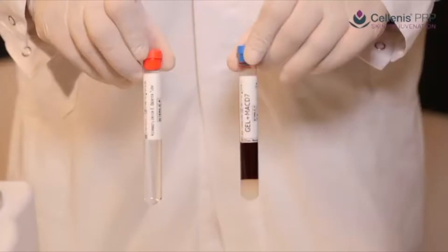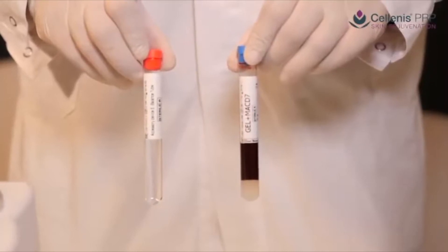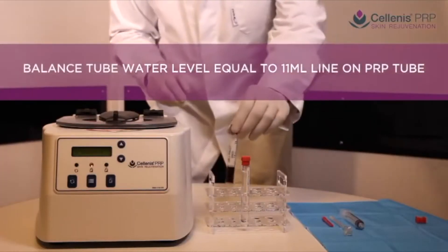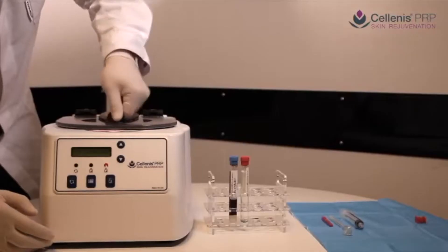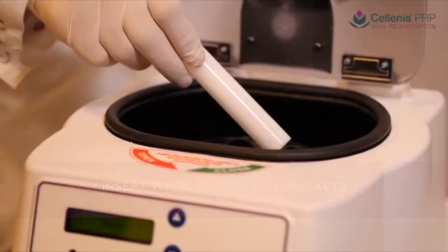A centrifuge must always be balanced. If using only one Solanus tube, fill the balancing tube with water to the level of blood in the Solanus tube. Both Solanus 11ml and 22ml blood draw tubes can be used in the Solanus centrifuge. A white spacer inserted into the bucket ensures a snug fit for the 11ml tube.